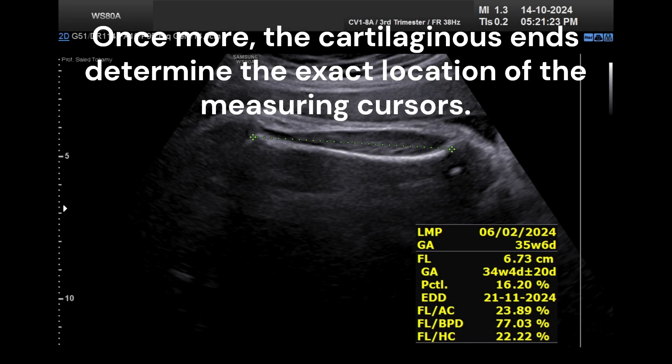The cartilaginous ends determine the exact location of the measuring cursors. The point where the cartilage and bone meet is where the cursors are positioned.